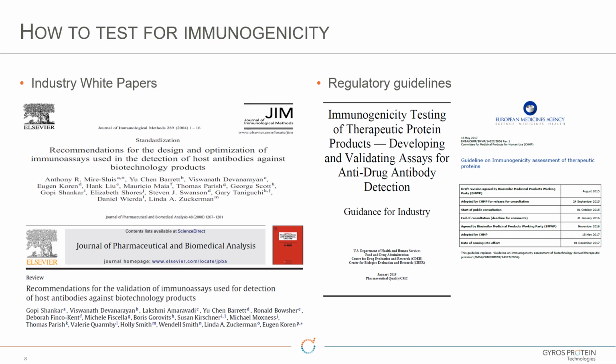Basically these industry white papers have been incorporated into both EMEA, European guidances, as well as FDA guidances. So the two white papers are a really good approach to validate and develop these assays. Yeah, and certainly our guidance is based on the theory put forward by these papers.